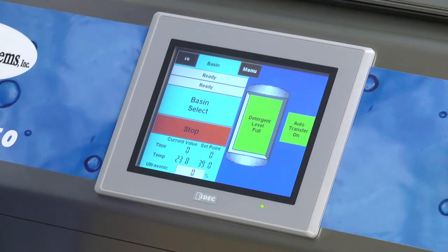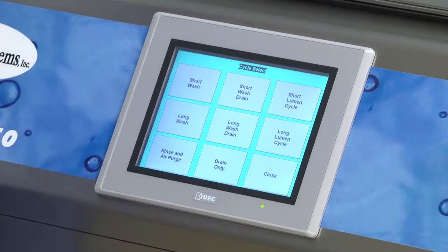From this screen, you have an Input Output button, a Menu button, Basin Select, Stop button, Time, Temperature, and Ultrasonic Percentage. Press the Basin Select button to select which kind of cycle you want to run. This brings up the Cycle Select menu.